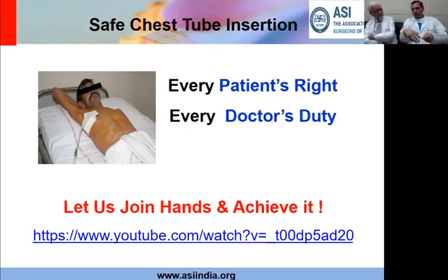First you explain to the patient that they have to take a deep breath in and hold, and then you pull out the chest tube. What I do is a maneuver of moving the chest tube and see that the patient does not start breathing. Many times the moment they have pain, they start breathing. So you have to tell them, please don't breathe, otherwise there will be problems. You tighten the stitch as the chest tube is being pulled out.